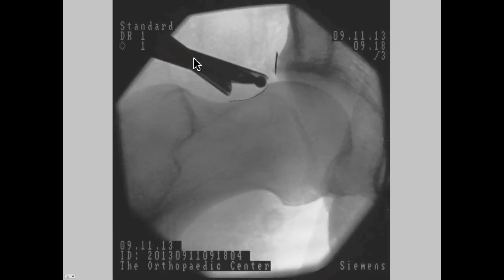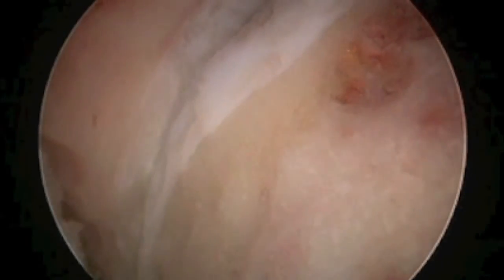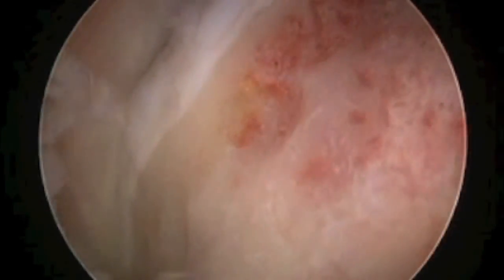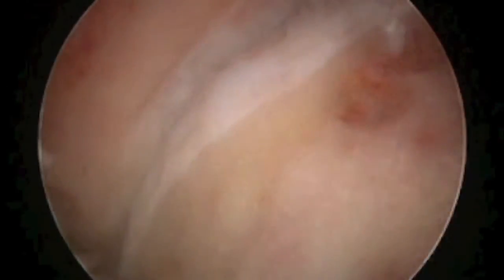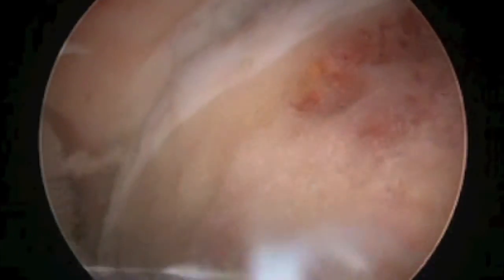Once that's done, we release traction. The joint space has narrowed down because traction has been removed. Now you can see the bump or cam lesion on the femur, and we begin work in that area. The bur slowly contours the femoral neck back to where it should be. You can also see the level of resection on the pincer side in this x-ray image, and there's very little joint space once traction is released. I work right along the cartilage margin to remove the cam lesion on the neck of the femur. With traction off, I can take the hip through a range of motion and directly visualize any points of bony impingement — actually performing the impingement test intraoperatively to confirm no bone remains that could cause post-operative pain.